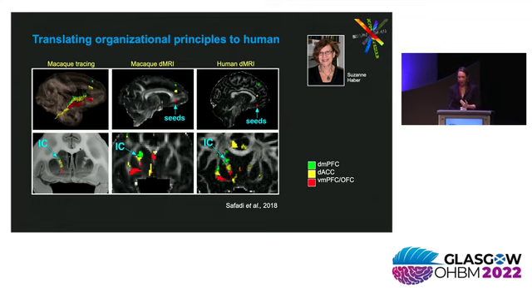Obviously, this isn't applicable to the human brain, so we can't do a point-by-point comparison with tracer there, but we can take advantage of topographies that Suzanne's group has been mapping carefully with tracer studies over the past few years, and we can evaluate the extent to which tractography can replicate the topographic organization of smaller fiber bundles in the white matter based on their cortical area of origin, how well it can replicate those topographies that are found from the tracer studies, and then translate that information to see if we can get the same topographies in the human data.